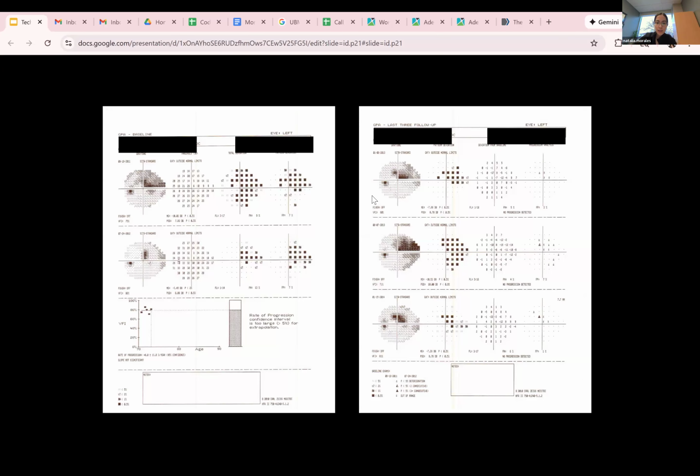So you can see that this patient's visual field almost looks like it's a little bit all over the place. The earlier ones here are to my left on my screen, and then I'm moving my mouse over to the ones that are a little bit more recent. What you do see is that these center changes or depressions are kept through all of them, but the amount of changes around the nose is variable. Like here in 2013, they have a lot of points that they're missing, but here in 2014, there are fewer points that they're missing.